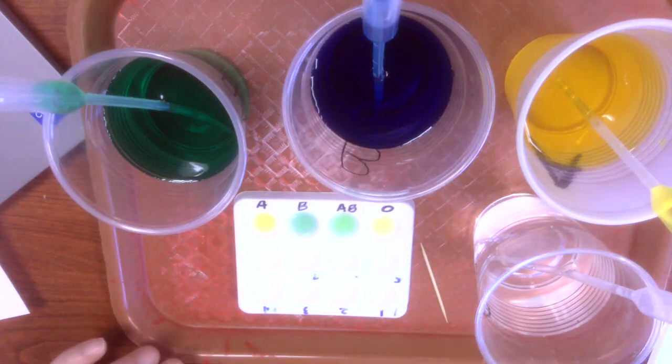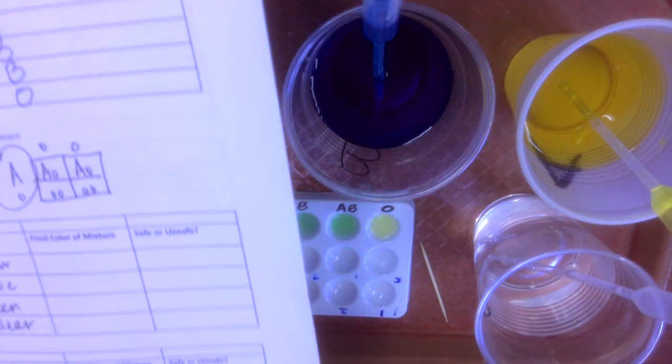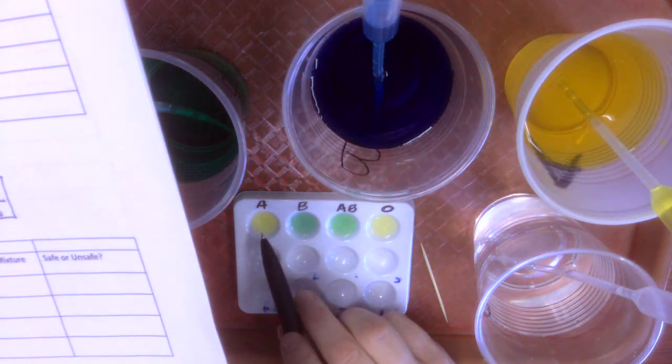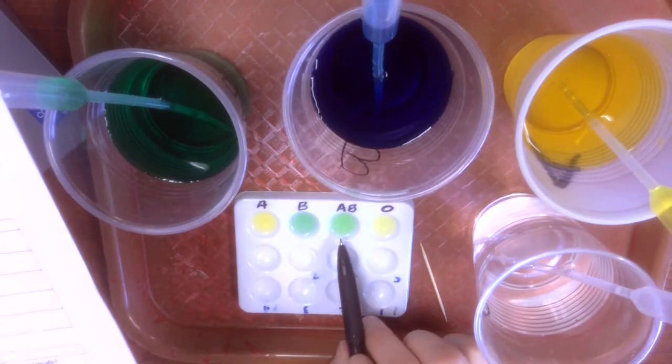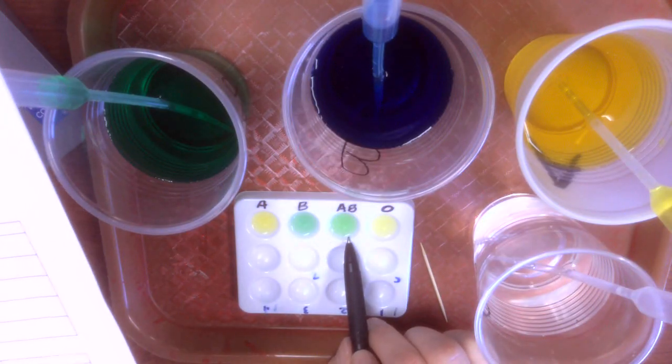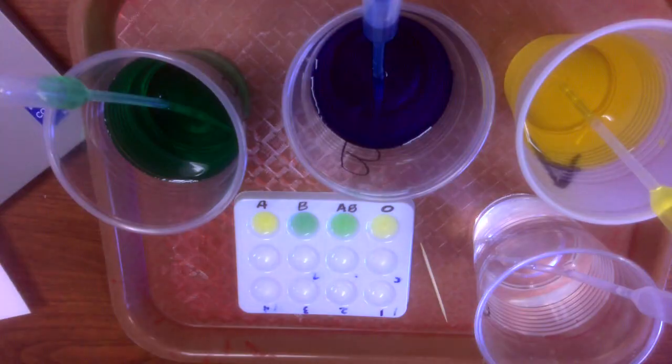Okay, here's what I got. My final colors. So I would say my final color A, I would say that's yellow. My final color B, it is green. AB is also green, even though it's a different shade, and O is yellow. Those are my final colors. All right, so I stirred them with a toothpick to make sure that they mixed well.